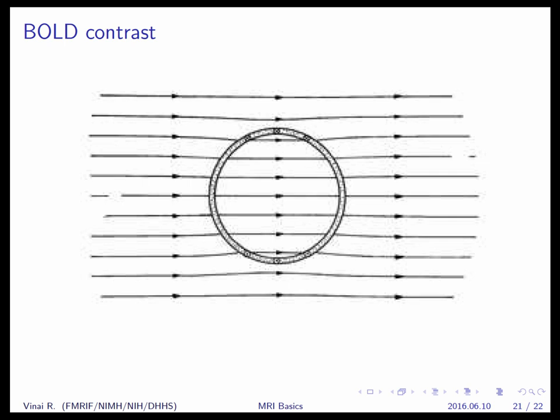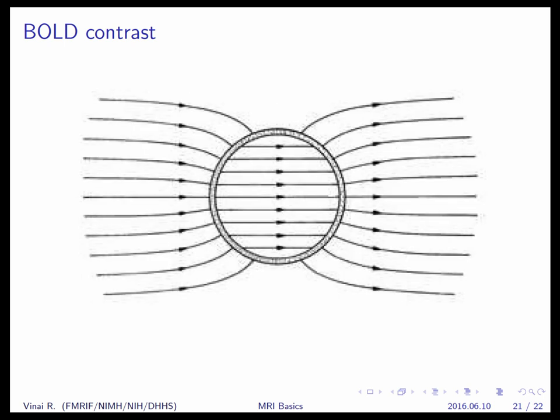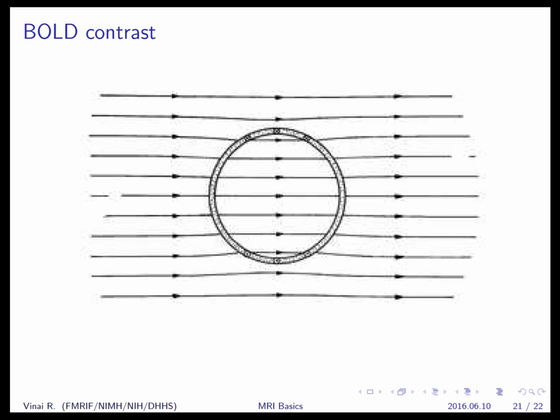No, so what will happen is in this case where we had high field inside the vessel, lower field outside, and then this gradient in between, you have a lot of dephasing happening here, so we have a lower signal in the time of the imaging experiment. Here, because the environments are more similar, there's less dephasing.